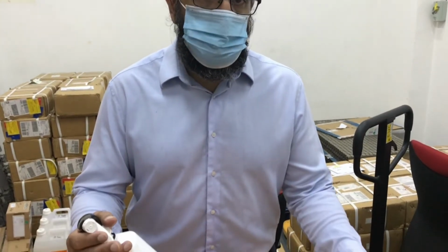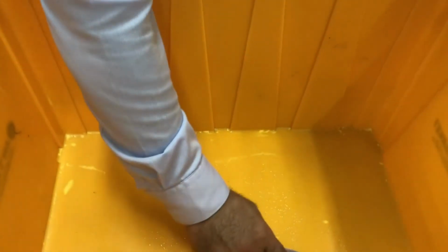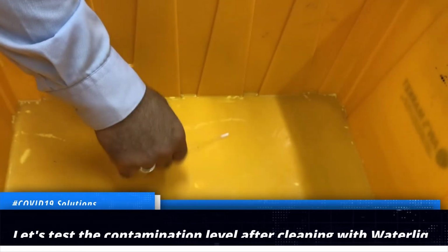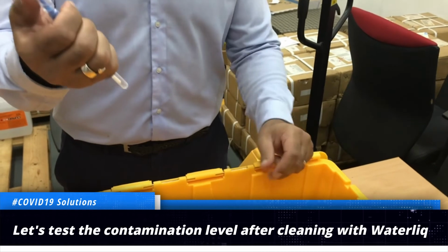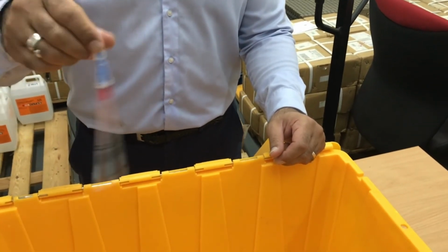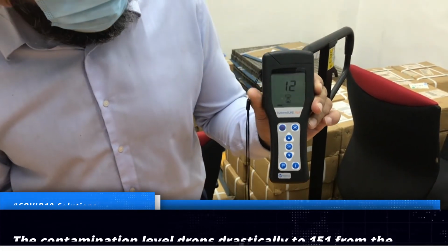So what we do now, after the first swabbing, is clean the surface with just Waterliq ready to use. Spraying. And cleaning. After that, make sure that the swab is bent nicely and turned around. Then put it back in, break, again for 5 seconds. Putting it in, closing it, and let's start the reader.